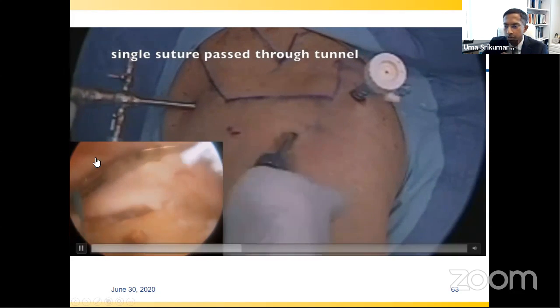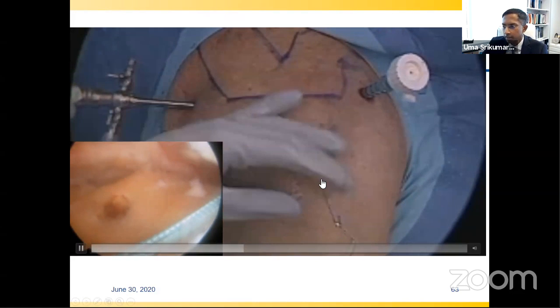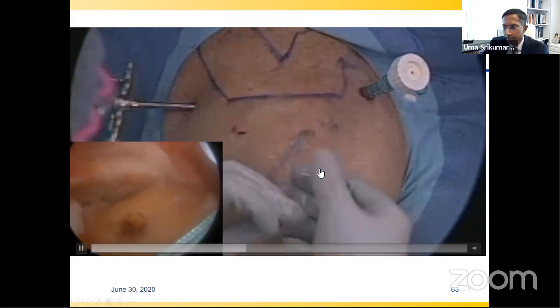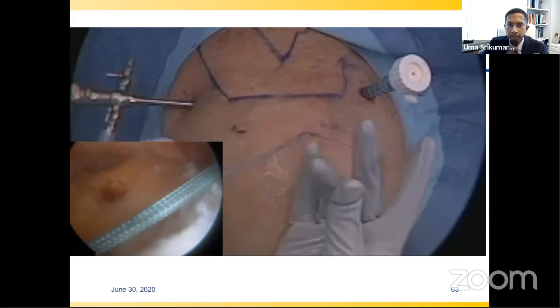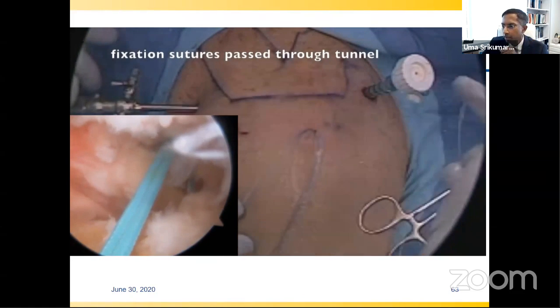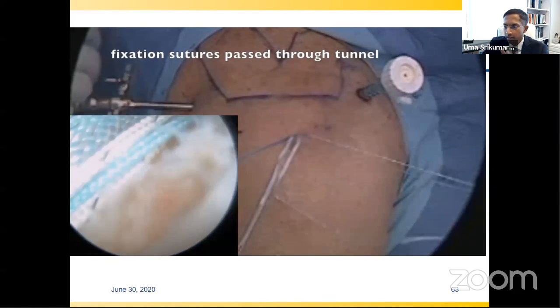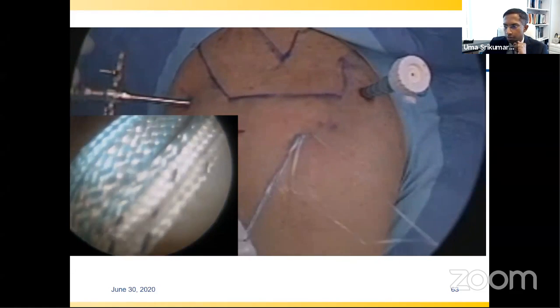Now you have a loop suture from the vertical tunnel through the lateral tunnel, and this is the passing suture. It's a loop. So you can choose to place any number of sutures through this loop, however you desire, which colors, which sizes. We usually place 2 sutures and 1 tape of differing colors to make suture management easier. That looped suture is pulled through to deliver the definitive fixation sutures.